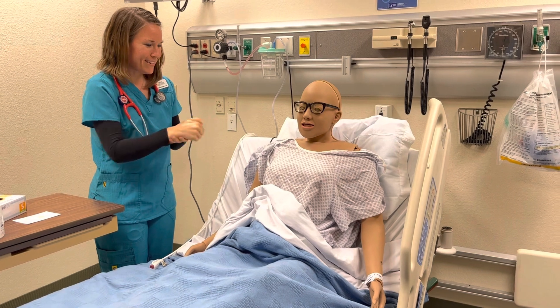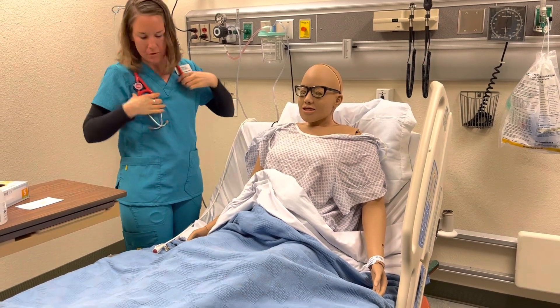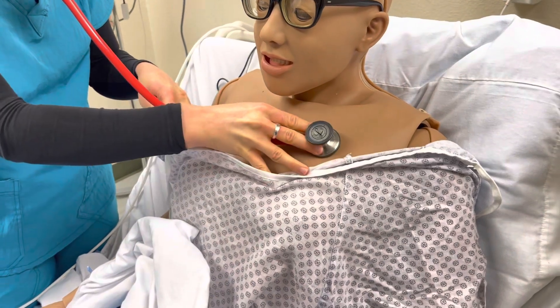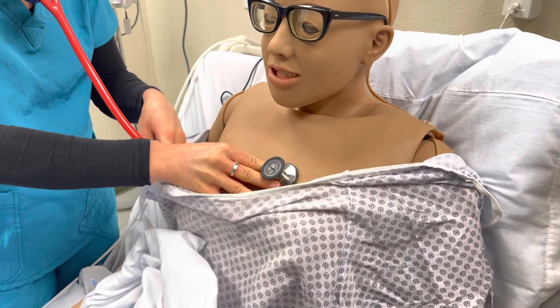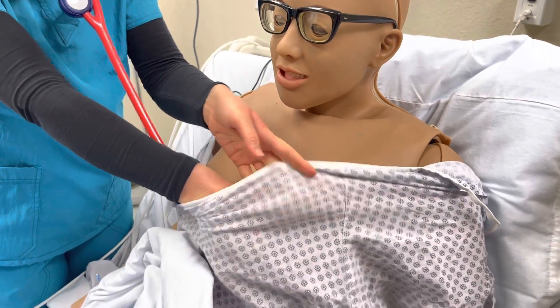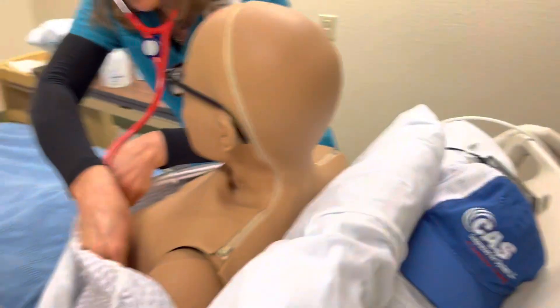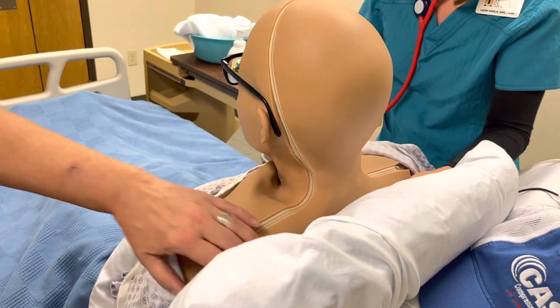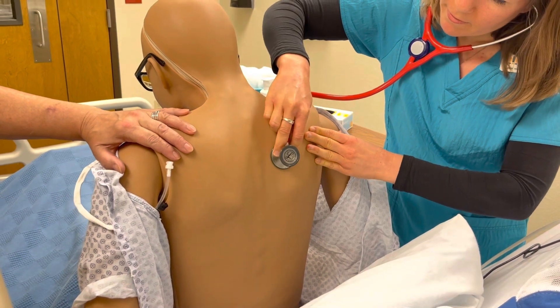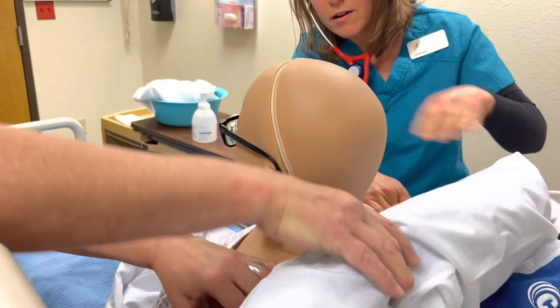So how are you feeling now that that's out? Feels a lot better. I bet — not the most comfortable. We're going to just assess your lungs one more time to make sure that everything is still good. Again, we have that door closed for your privacy. Also going to do one pair on the lateral, and then four pairs on your back.